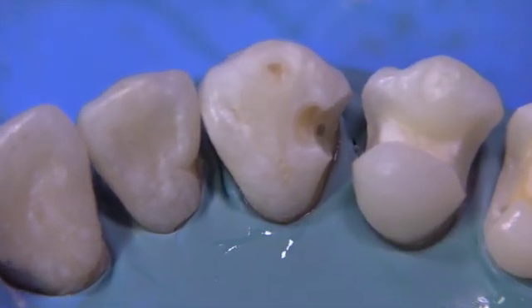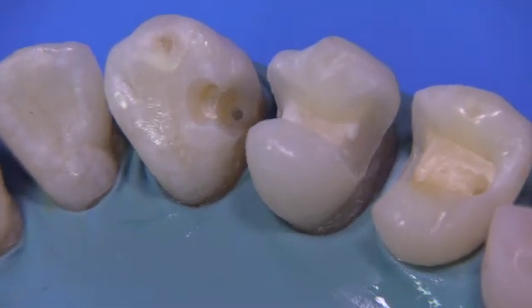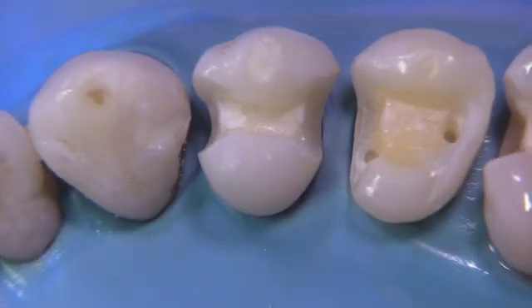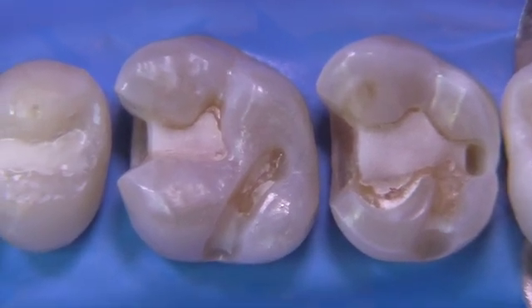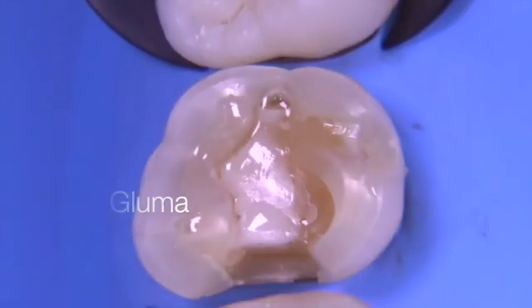We have an interesting assortment of restorations: a pin-retained casting with a sort of experimental MOD with hollow grinds, a pin-retained casting with an onlay, a two-part inlay on a first molar, and an onlay. We're going to apply Gluma first.